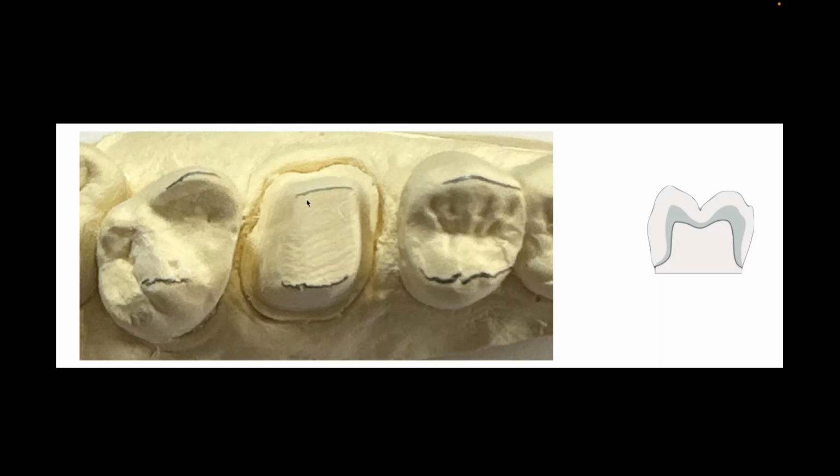What does that mean? How do I take that prep that has the exact same occlusal table as the opposing teeth and get my cusp tips to go into that position? I almost can't. And what's going to happen is functionally, I'm going to have a problem here because I can't get my cusp tip where it is because the prep didn't finish in the right position. So your knowledge of that is going to help your partners be able to show them. And I've taken this picture 1,000 times over the years.